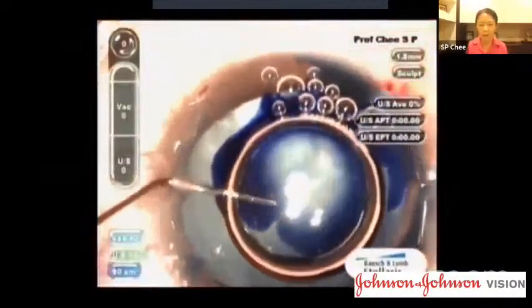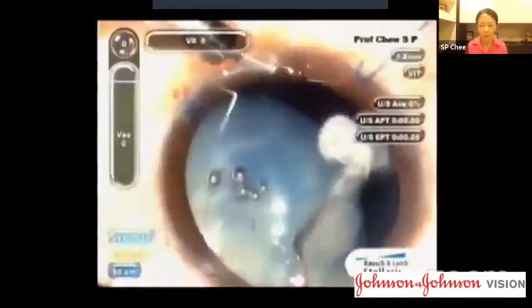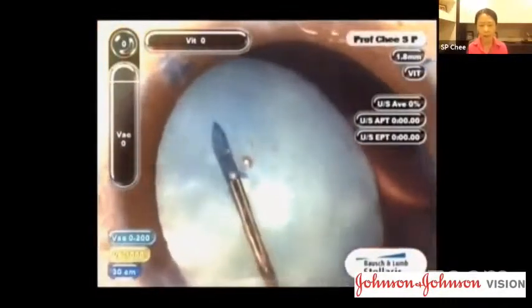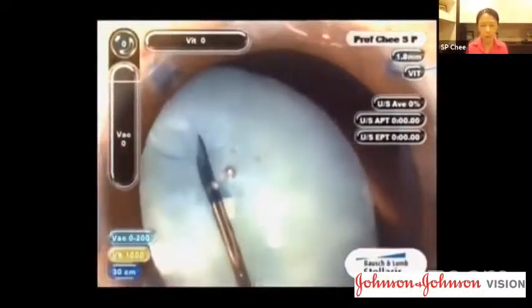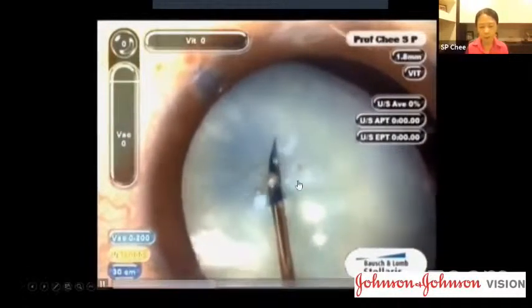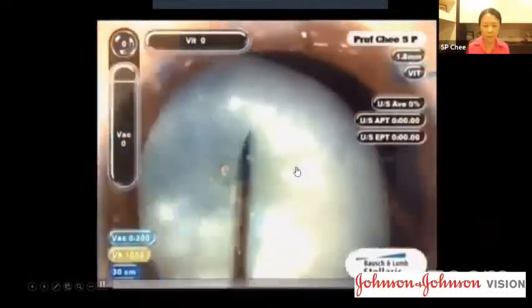I'm going to show you the third case now. It's a bit more challenging because this is tilting backwards and there's some vitreous, which, you know, we removed years ago. All right, so I have to aspirate. I was worried. I used the capsular dye stain to stain, and I was very cautious because I didn't want to stain the vitreous, which you well can do, all right, if you are not careful. So I'm putting a 27-gauge needle to initiate the rhexis as well as aspirate to decompress this intumescent lens.